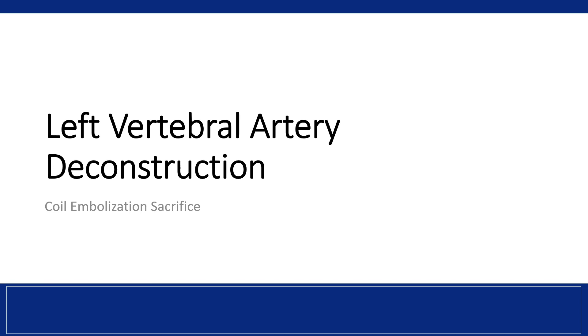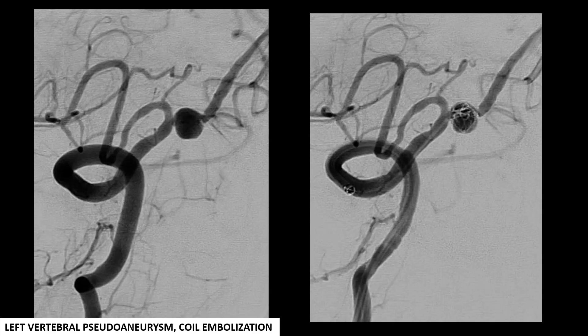Attention was then turned towards the left side. A Headway microcatheter was used to access the pseudoaneurysm and coil embolization was performed. During coiling, the microcatheter was kicked out of the pseudoaneurysm. Given the close proximity of the left PICA origin and the significantly slow distal filling, coiling was stopped. Contrast washout from the reconstructed right vertebral artery was noted distal to the coiled pseudoaneurysm.